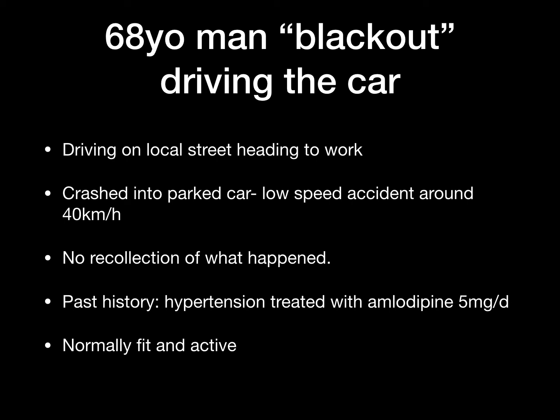Again, we sort of come back to the ECG. So the ECG is abnormal, and the left bundle branch block can imply underlying heart disease. So the left bundle branch block could suggest myocardial infarction, as we saw before, but it also suggests underlying conduction system disease because the left bundle is blocked or not working properly.